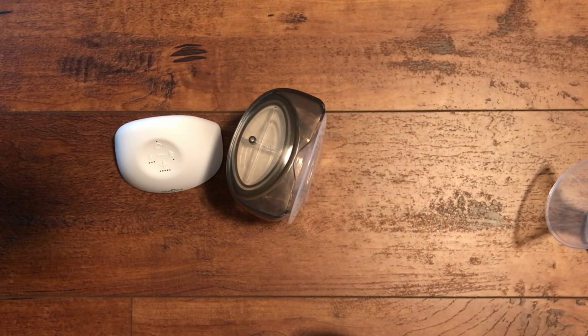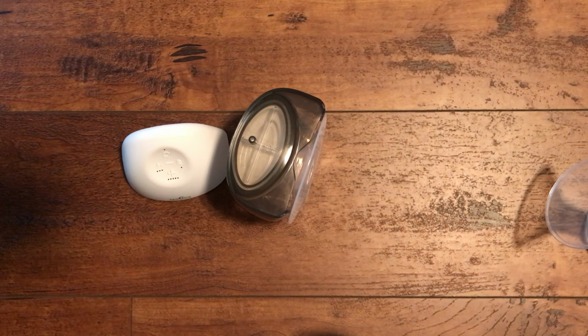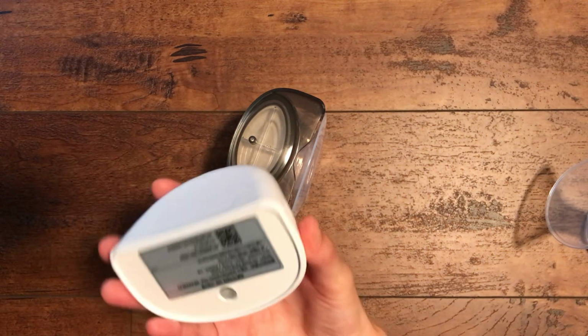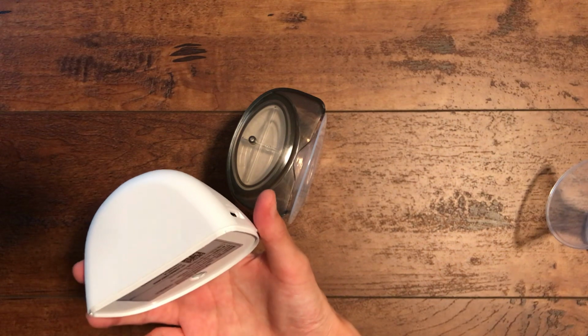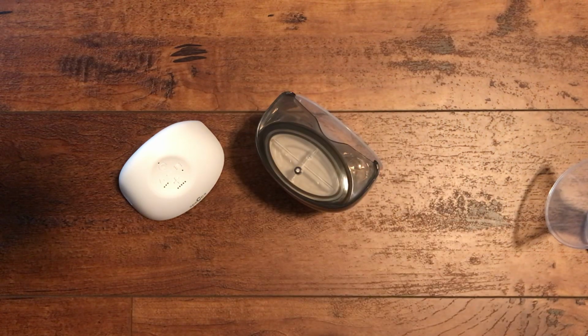And since I pump about 20 minutes each side, if I do 2 breasts, then that's 40 minutes. Since this has a battery life of about an hour and a half, that would be enough for at least 2 full pumping sessions for me. But I usually try to charge it right away after each pumping session, so that I don't have a drained battery for the next time. So you can do that as well. So yeah, that was an overview of how I've been using this pump, and I'll go over the cleaning part next.